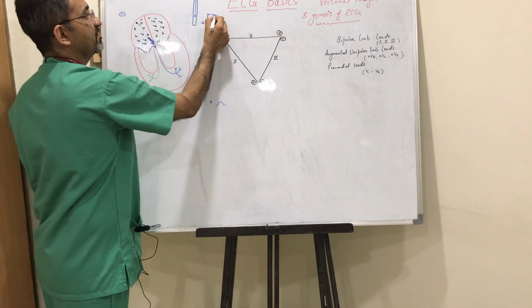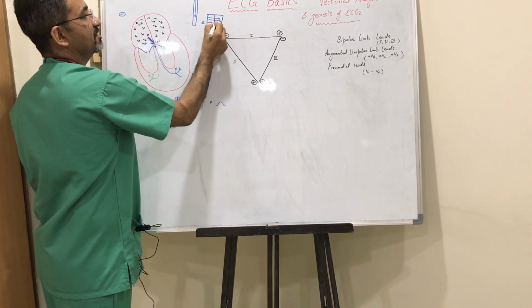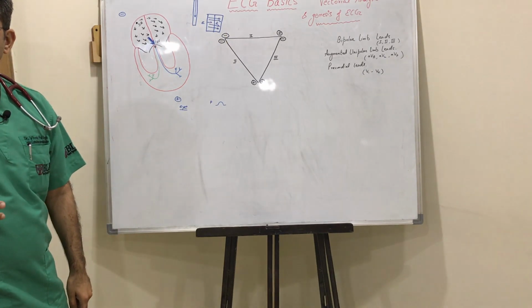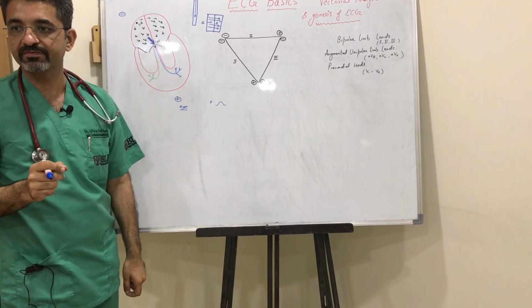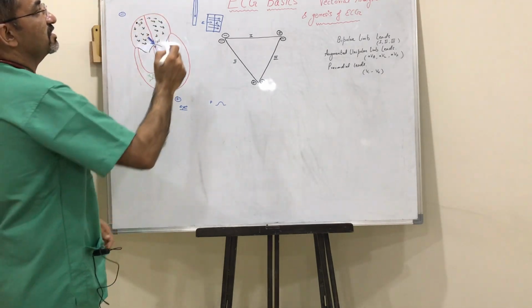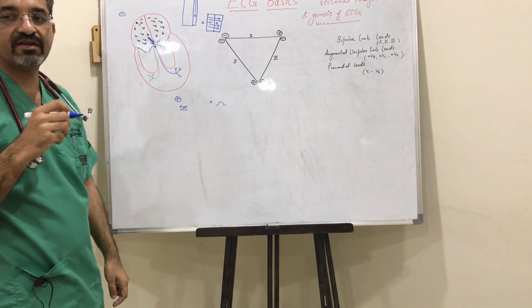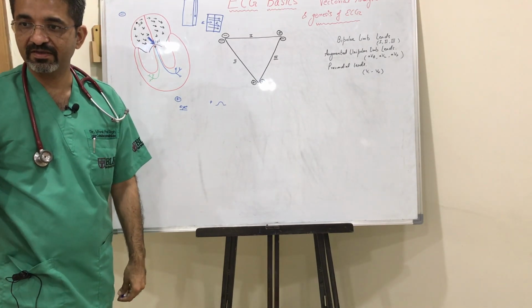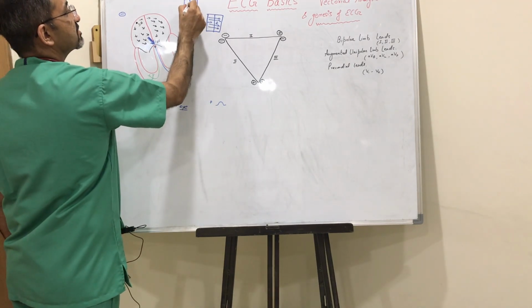Even though the ventricles enlarge to double their size, the activation will be simultaneous. So that is the reason VFib is much less common as compared to AFib. One more important aspect is, even if the atria hypertrophy, we always say atria enlarges. The reason being, atria can hypertrophy, but we cannot judge it in ECG, because the movement is like this.